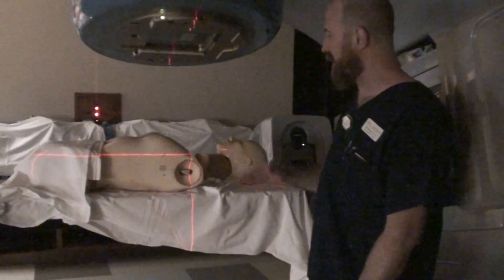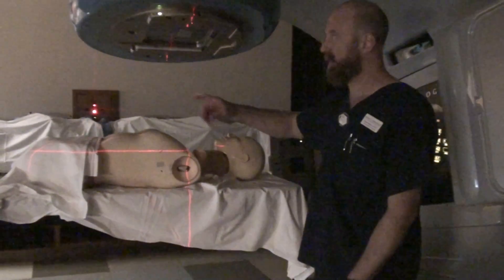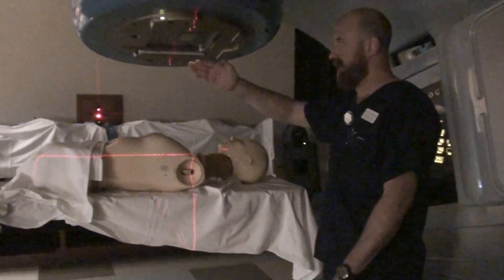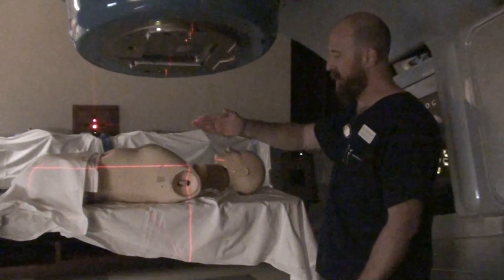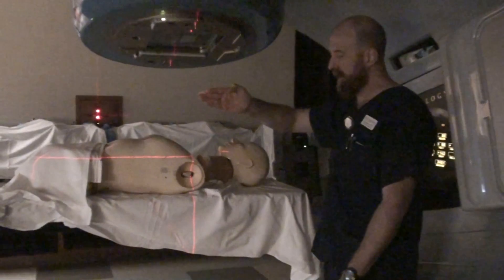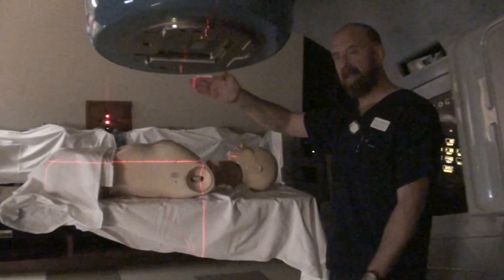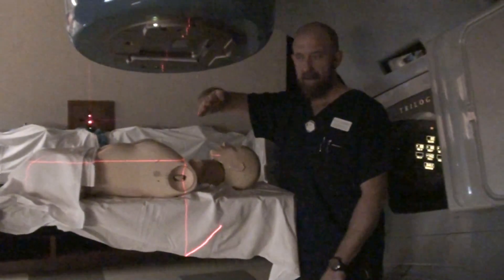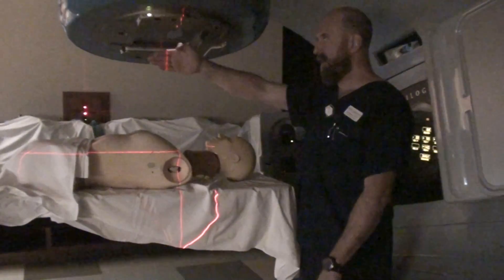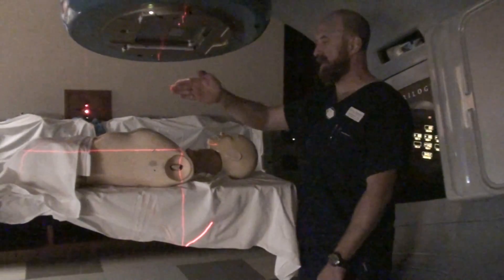15 degrees off. As we discussed in class, we talked about diverging fields at the lateral aspect in the last video. You've also got a divergent field from the anterior. If the doctor is worried about the medial part of the field diverging and getting a little too deep in tissue and possibly getting close to the spinal cord, you rotate the gantry over — going from a diverging beam to a flatter beam. So 15 degrees off will flatten this medial edge out so that it's coming down at a straight angle instead of a diverging angle.